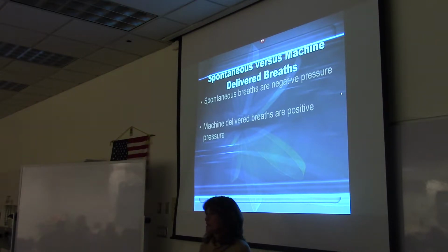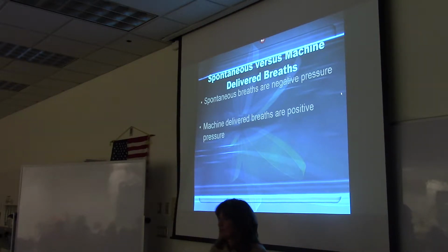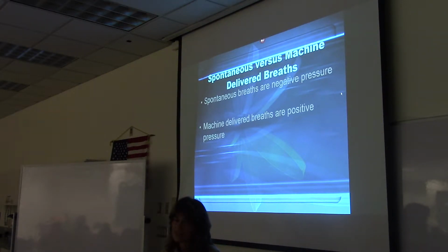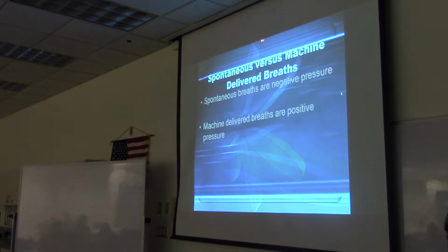We always have to keep an eye on how much pressure builds up in the lungs, because yes, we're trying to save a person's life, but too much pressure and we're going to damage their lungs for the rest of their lives. So yes, we need positive pressure to ventilate, but that positive pressure can also cause damage. Here it says, spontaneous breaths are negative pressure, but machine-delivered breaths are positive pressure.